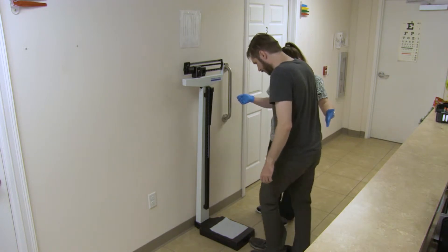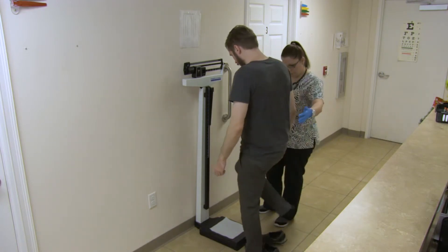Have them stand at the center of the scale and use the grab bars on either side if available to help them balance. Then have them put their arms down at their sides once they are steady.